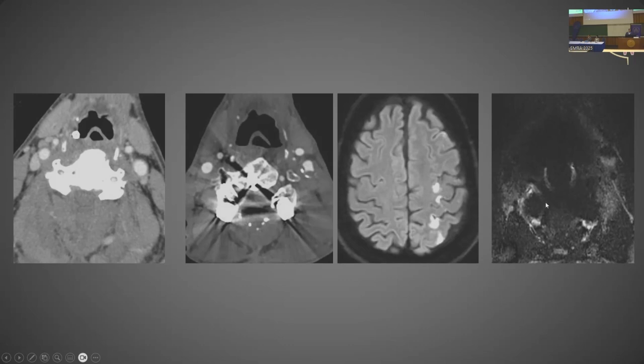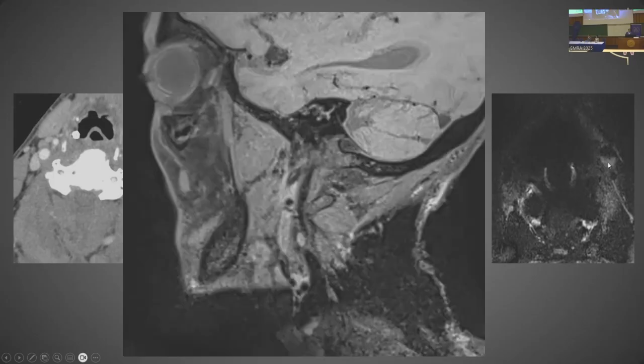Vessel wall imaging is a little affected secondary to the hardware. We can see there's that plaque. If we look at it on the sagittal view, we can pick it up a little better along that undersurface of the plaque. There is intraplaque hemorrhage within that plaque and a little bit of an ulceration there that we saw in the CTA. But in this setting, as we mentioned, that IPH is predictive of future strokes, that ulceration may not be.